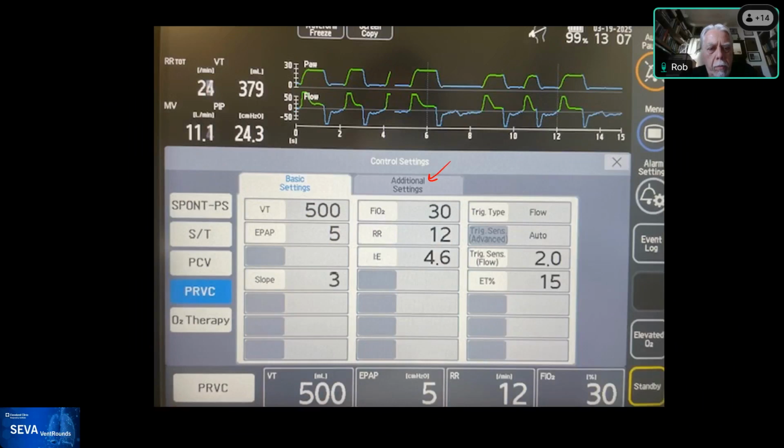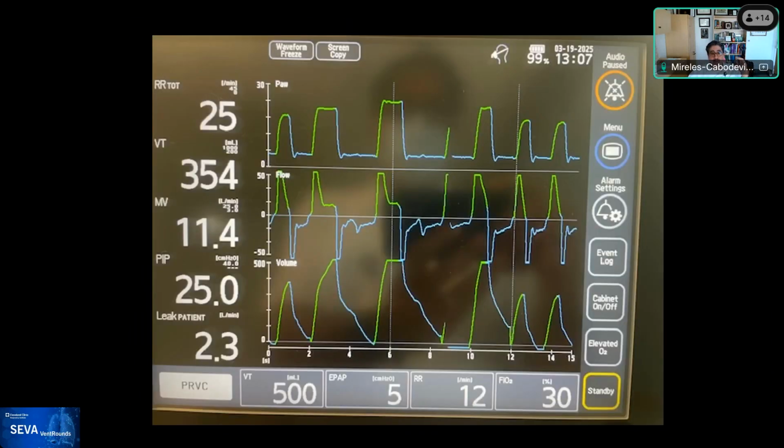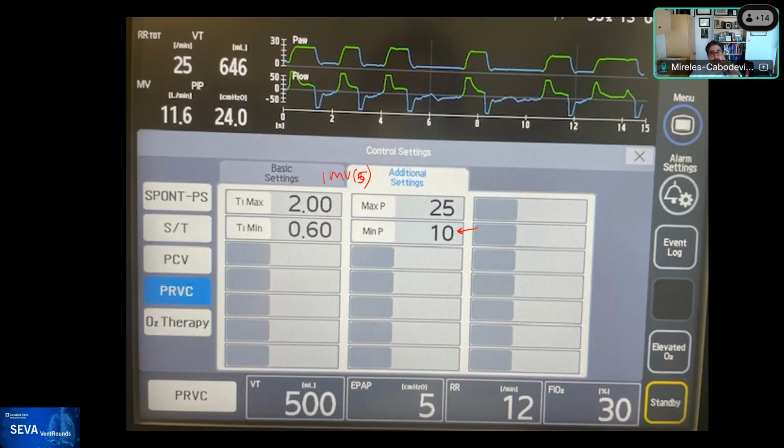Okay, so that's what we can infer. Now you know why this is a type 5 AA. Now, a thing that you should know is that if you see this breath sequence, it's actually this breath sequence. Give me a second. Yeah, it's this one over here. So this one is a breath sequence for this patient later on.